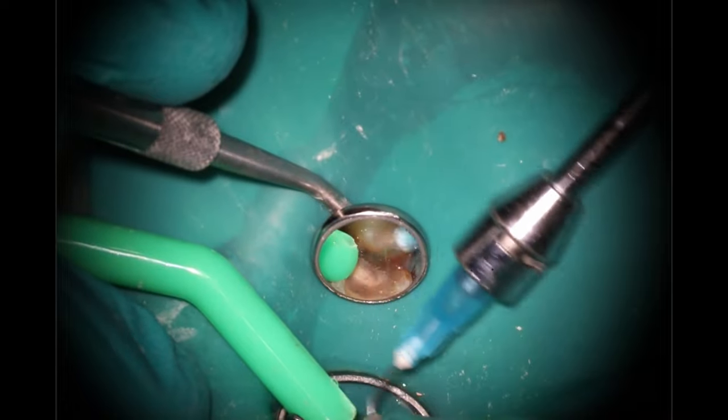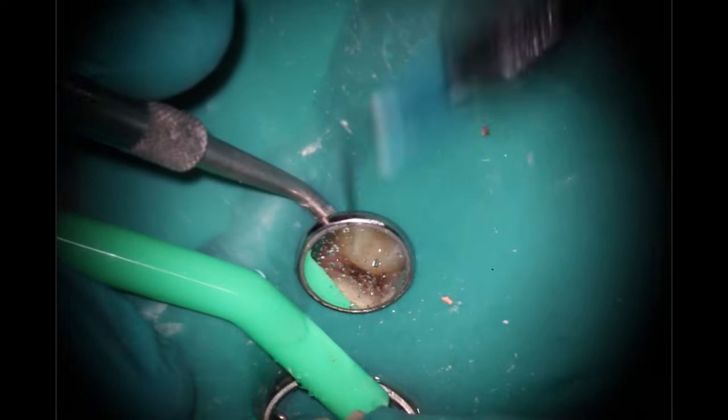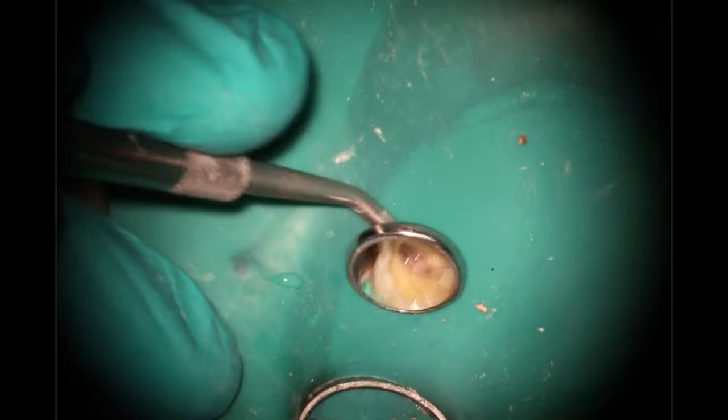You'll see Jenny's in there suctioning during this period as well. We're going to dry that off. After we get everything nice and dry, I'm going to see if there's any bleeding points. I've already asked her, telling her that I'm going to need the alpha tip, which is going to come in after. So that's what she's grabbing right now.